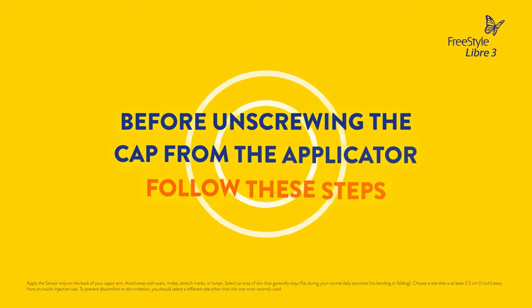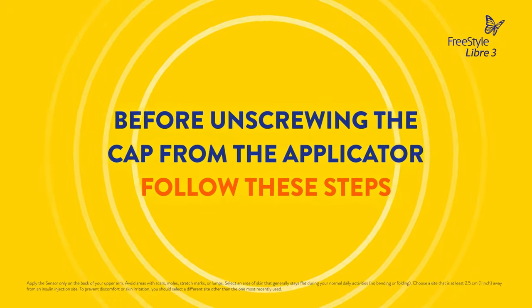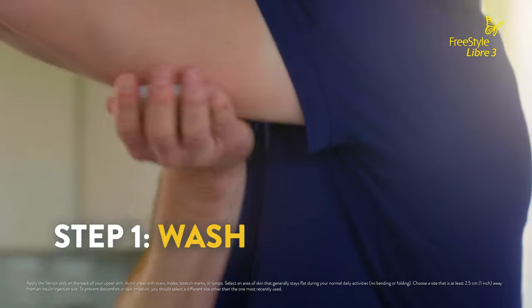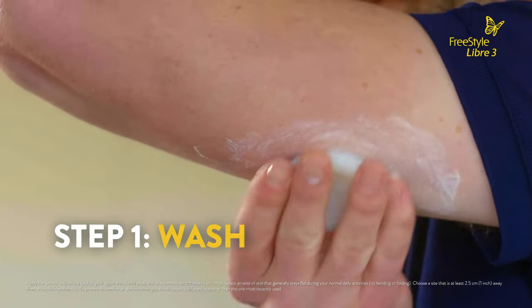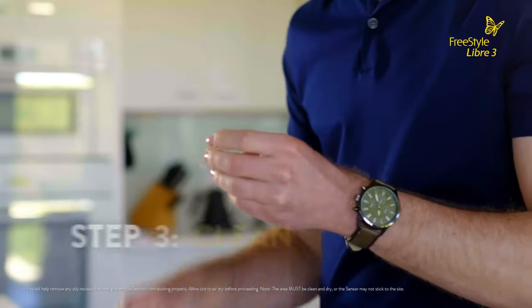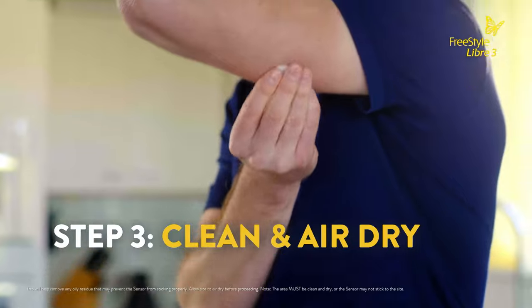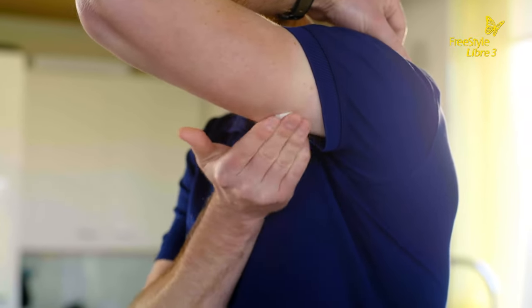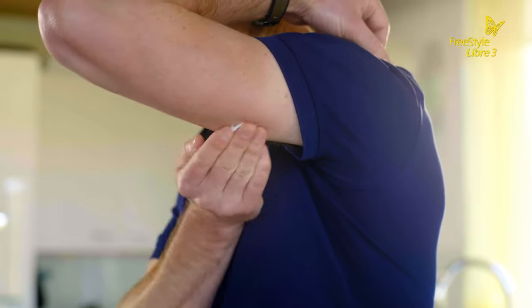Before unscrewing the cap from the sensor applicator, follow these steps to prepare the back of the upper arm. Wash the back of your upper arm using plain soap and water. Wipe dry with a clean towel. Clean with an alcohol wipe and then let air dry. Following these three easy steps helps ensure the sensor stays on your skin.